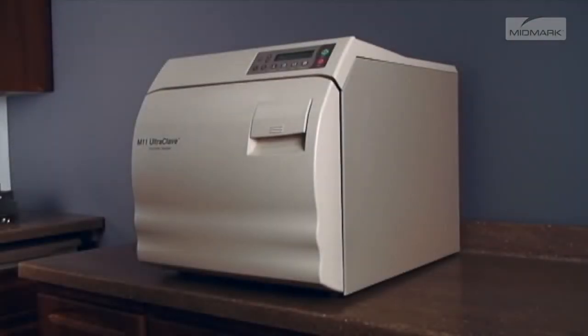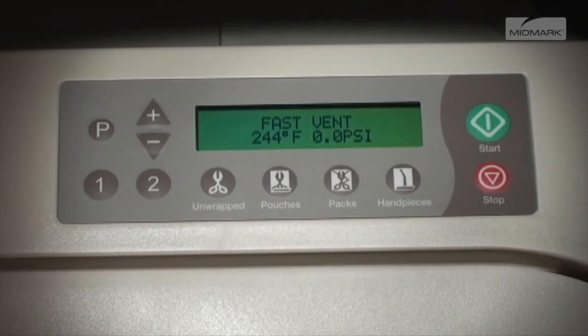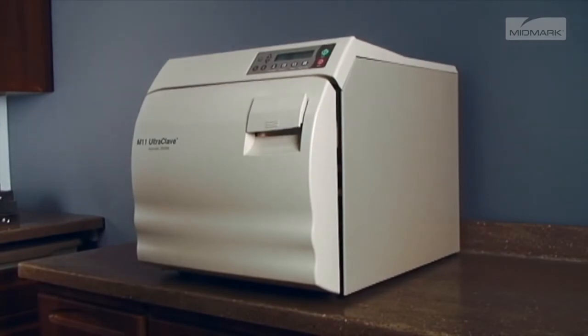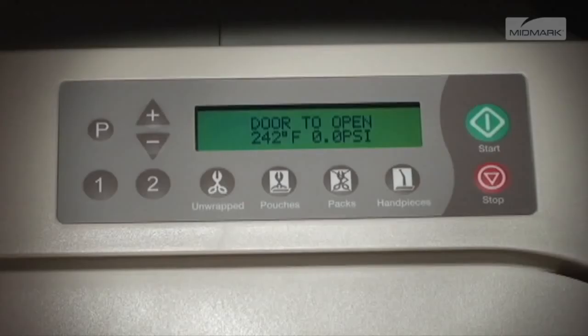Keep clear when the M9 or M11 door is ready to open. Failure to do so could result in severe burns from steam being released. An audible signal is emitted to indicate that the door is about to open. When pressure in the chamber reaches zero, the door actuates to a partially open position, beginning the drying cycle. The autoclave displays the amount of time remaining for the drying cycle and counts it down to zero. At the end of this countdown, an audible signal is emitted for 10 seconds, indicating that the sterilization cycle is complete.